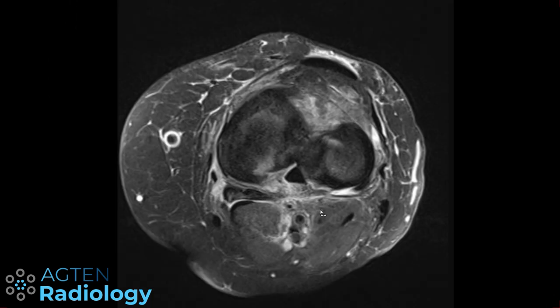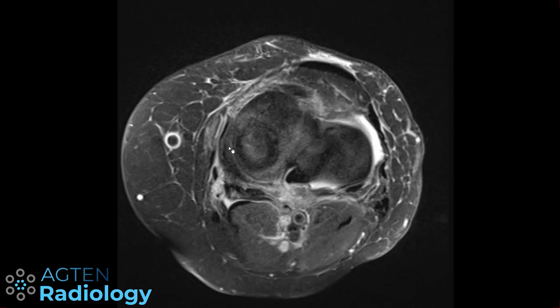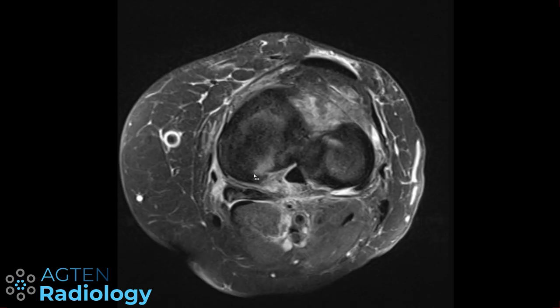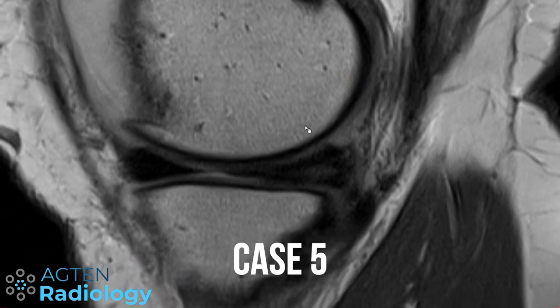Again, always look at the axials as well, and we can see here parts of the medial meniscus. Then you can follow it through here, and you can see that there is a gap. So this is a large radial tear of the posterior horn of the medial meniscus. However, keep in mind that not all tears are nice radial tears there.